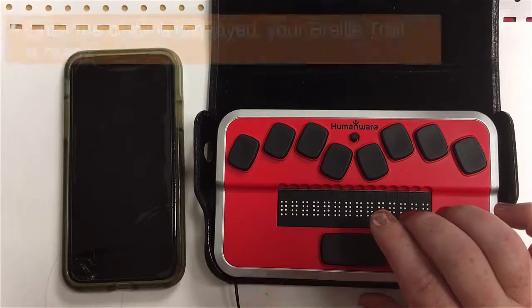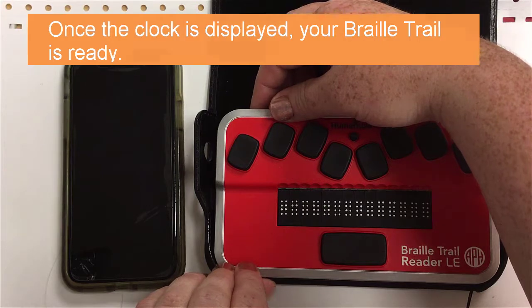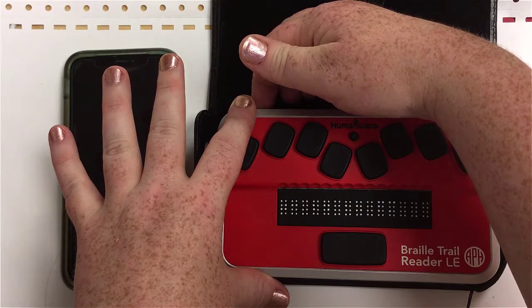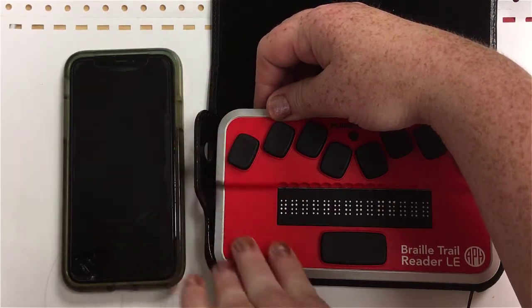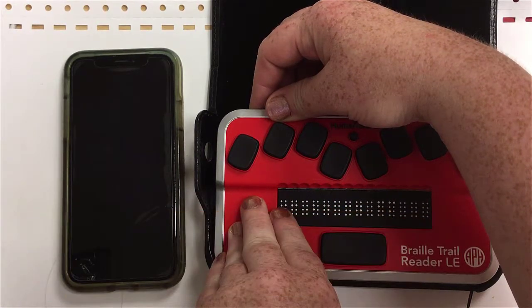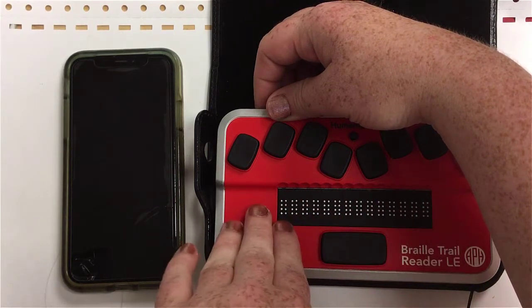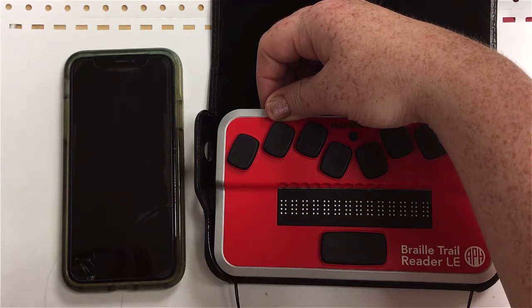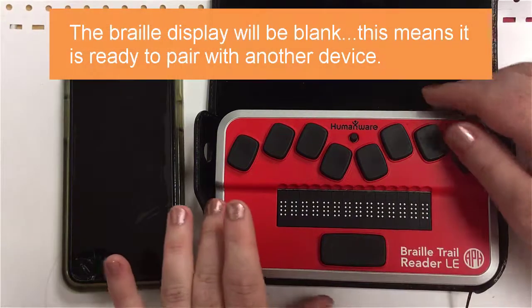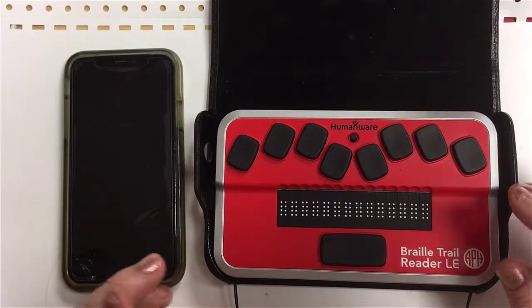That tells me my BrailleTrail is on and ready. I'm reaching back to the terminal switch we've talked about. We're putting the terminal switch into terminal mode, which means all the way to the right. You'll hear a click, and there is nothing on the display now. That's because our BrailleTrail isn't showing things from its own memory — it's ready to accept another device.